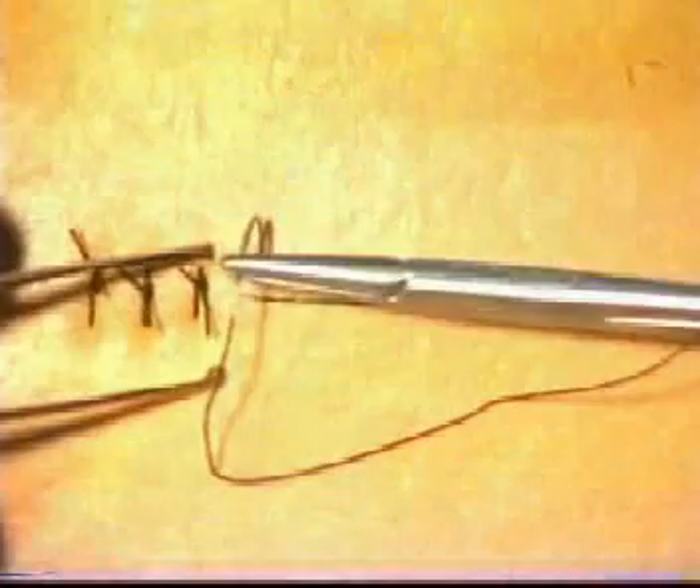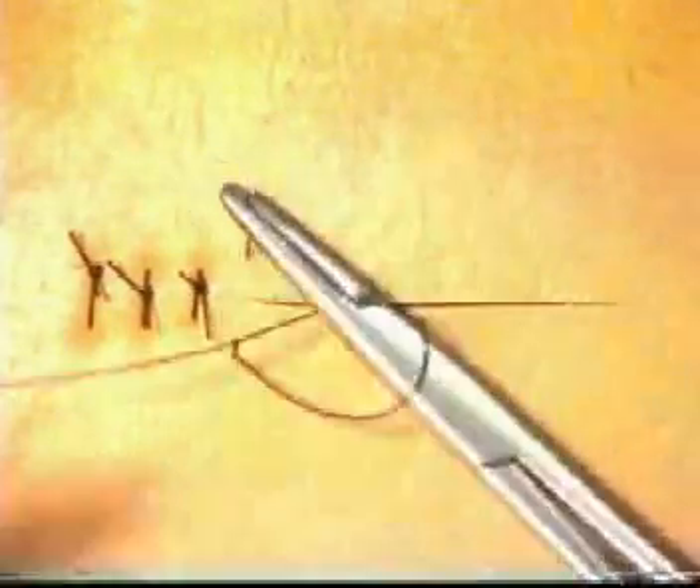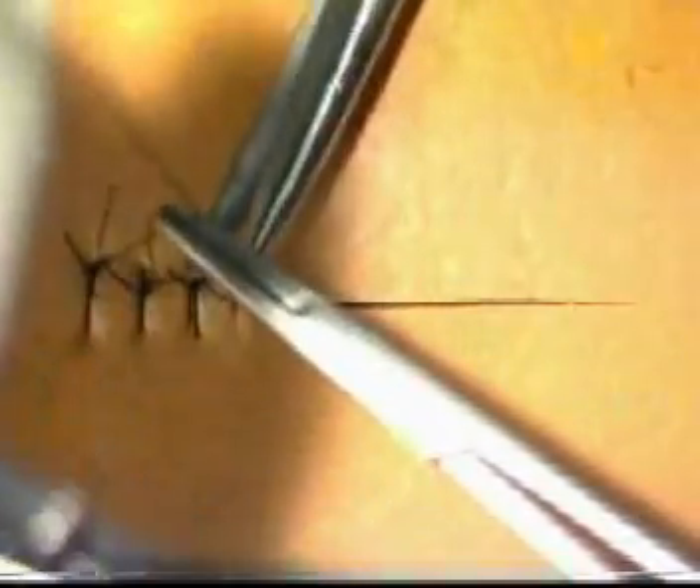When inserting sutures, adopt a one-two-three technique: one, two, three. Once again, tie your knot, making sure that it lies correctly without any tension.